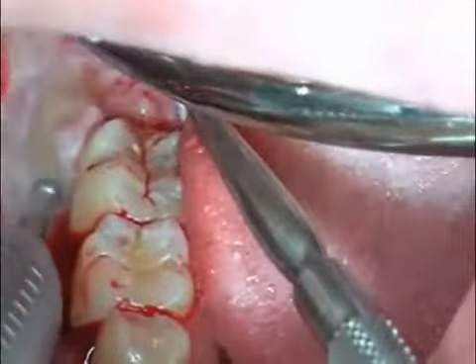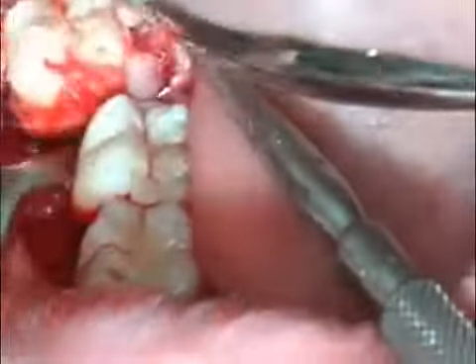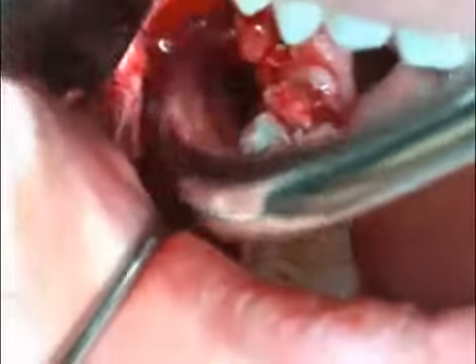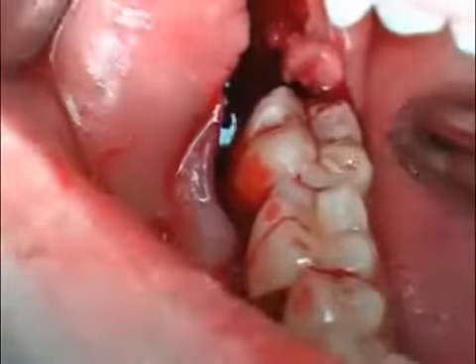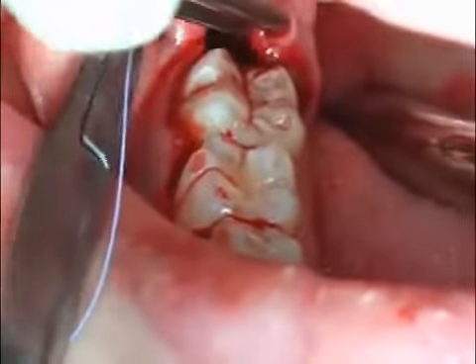Although the sound of this procedure roars in your head, you don't experience any pain. As soon as the bone is exposed, the instrument is changed. Now the tooth is dislocated with the turning tool and removed as a whole. Any bone chips are rinsed off, and the dental follicle is removed as well. Wounds in the mouth heal from the inside out, so you don't have to worry about a hole remaining or food scraps that might become ingrown.